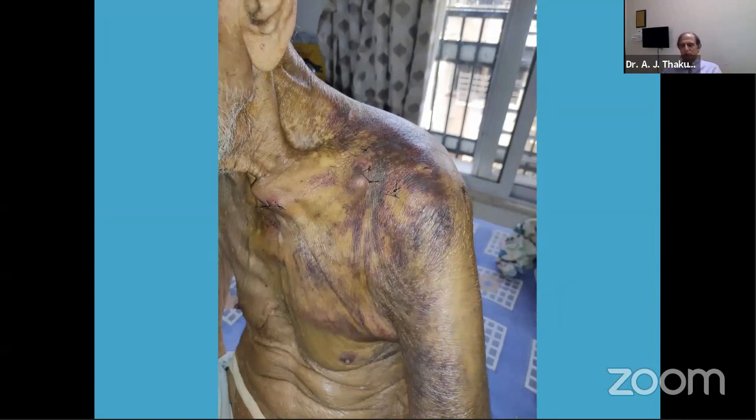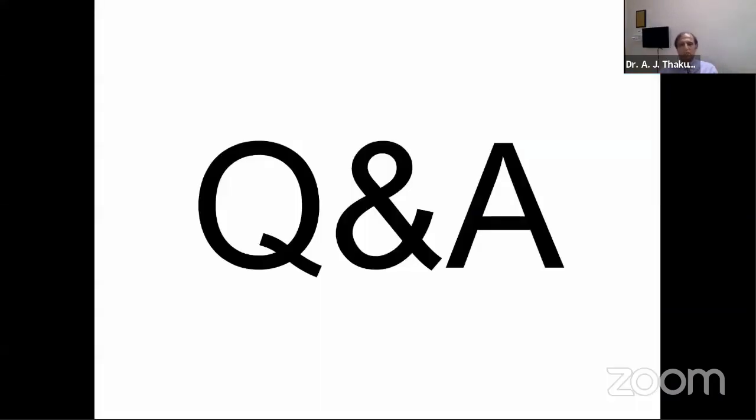So nailing of the clavicle with elastic titanium nail is a very good procedure. We need an image intensifier. We need to know how to position your machines, and then a successful result can be taken up. So on shoulder, if you have questions, we'll take them up now.